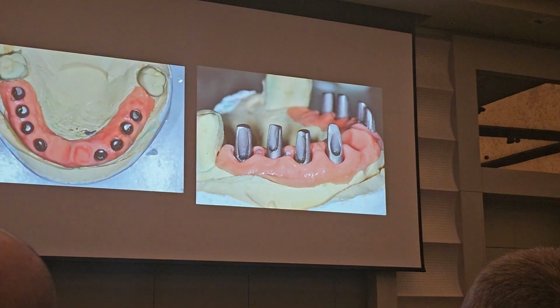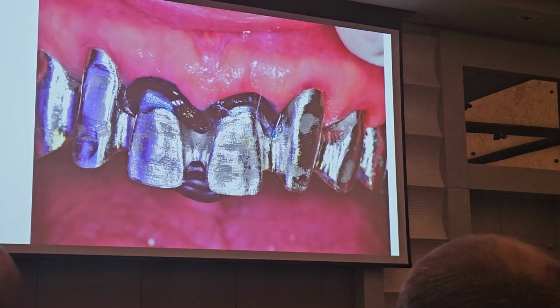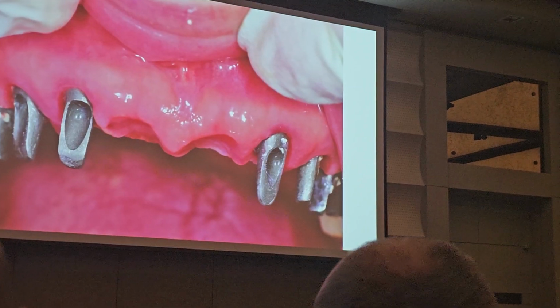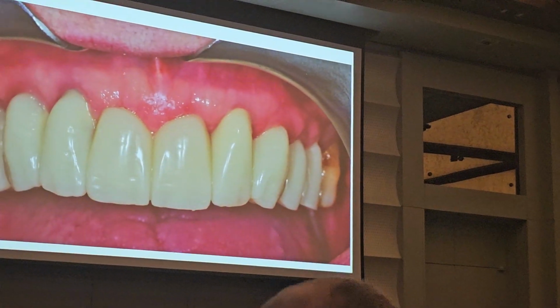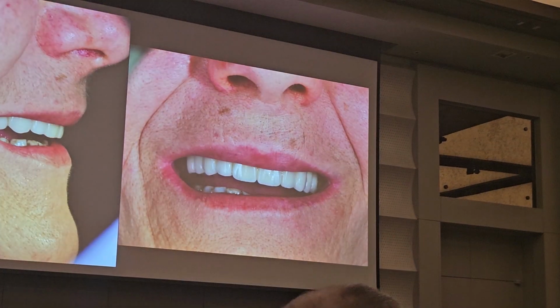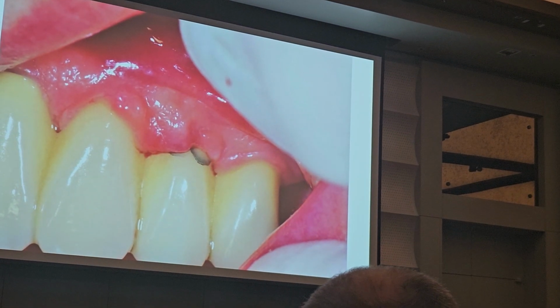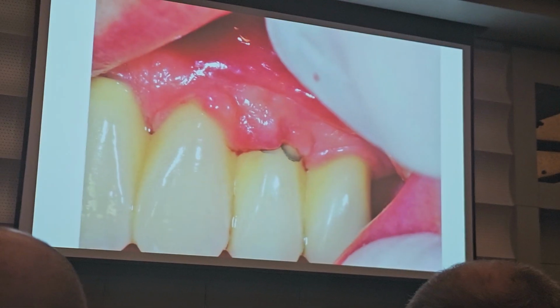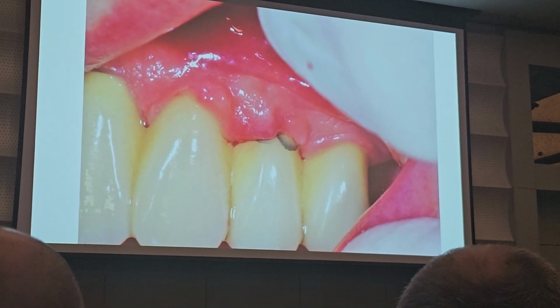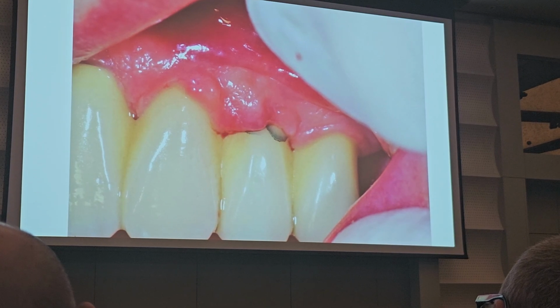Fresh. We decided to do a cemented prosthesis. Everything was fine, till we used the same laser melting metal. Okay? Even in this patient, we had the same problem.